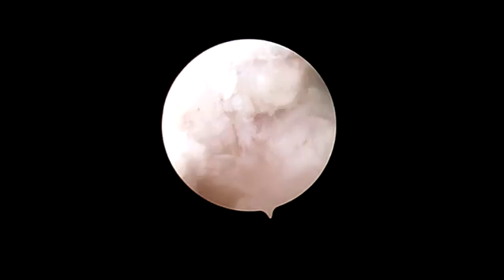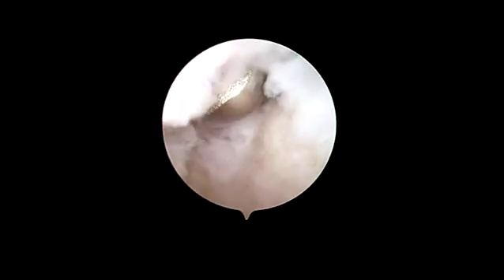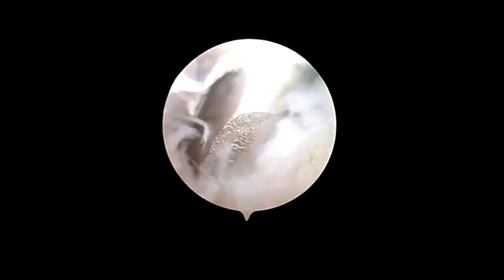This is followed by synovectomy of the ulnar recess of the joint, with the dorsal radial portal as the viewing portal and the dorsal ulnar portal as the working portal.